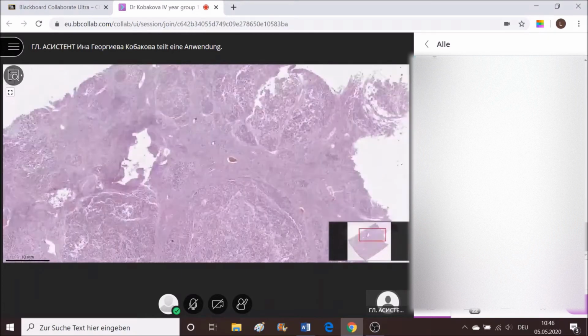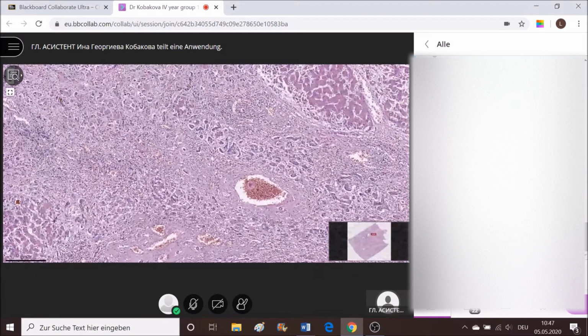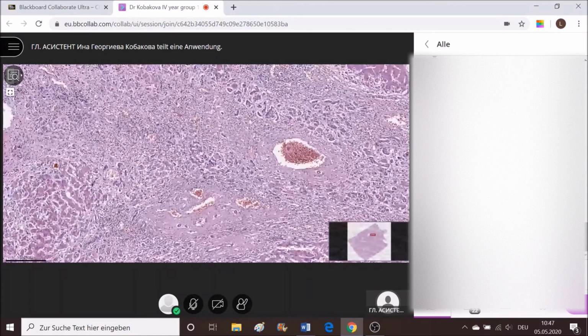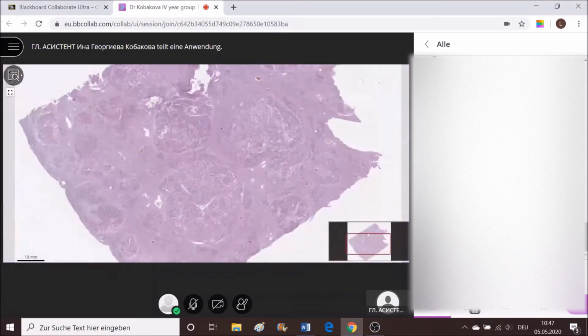There are some small portions of hepatocytes which are situated in some fibrous fields in between some hemorrhagical changes. Cirrhosis, great. That is cirrhosis. Can you describe it now? I will spare my description. I think I should give you some ability to describe it by yourself. Take a look at the slide first on a smaller magnification and then on a larger one, and describe what you see.